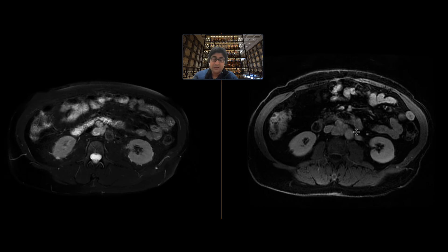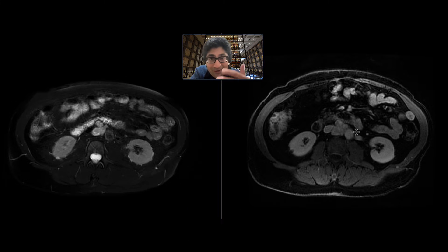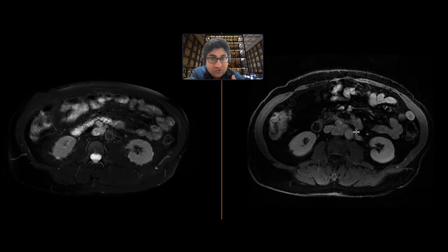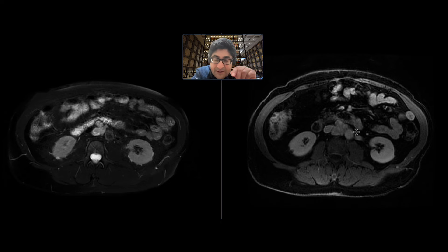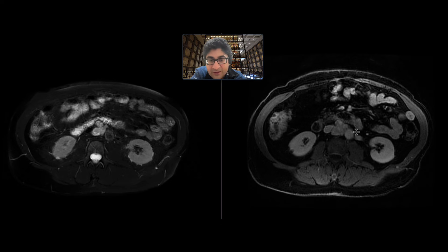The patient had other symptoms of refractory hypertension and elevated catecholamine levels, so they were looking for a paraganglioma or potential pheochromocytoma. They identified this mass in the retroperitoneum, which is a great appearance for a paraganglioma arising from the organ of Zuckerkandl — a collection of cells right at the aortic bifurcation, typically in the area of the inferior mesenteric artery.